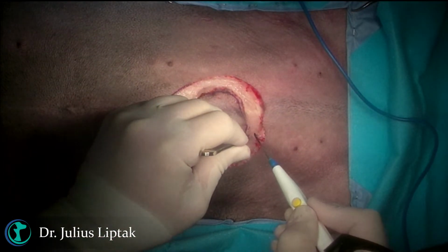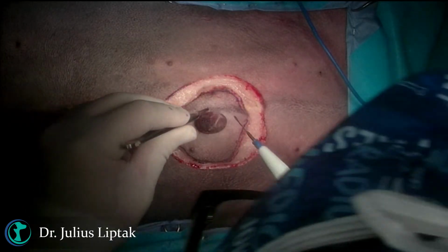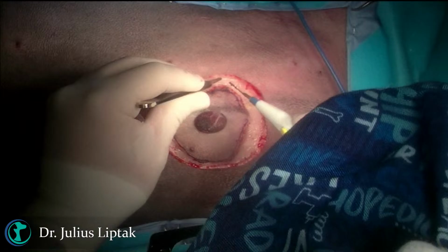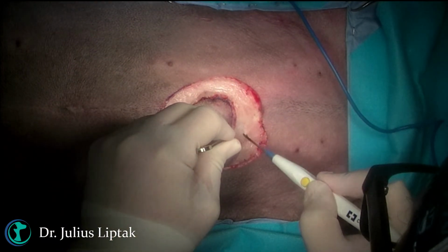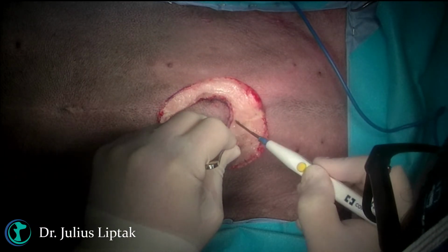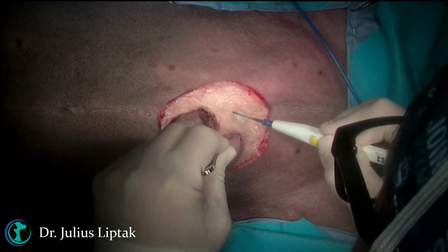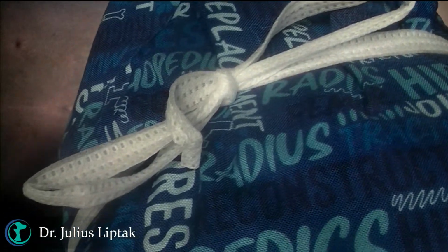So this is where Sarah Boston and I differ a little bit in that my deep margins are kind of around this tumour deeply rather than perpendicularly down from the subcute margins or from the lateral margins.